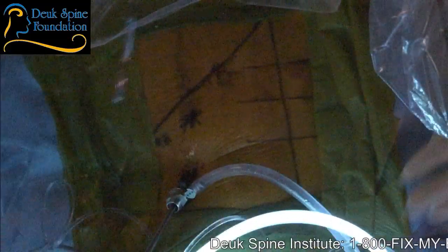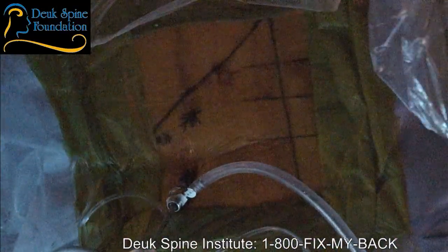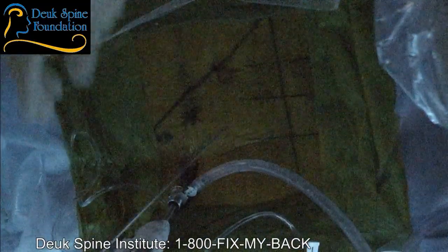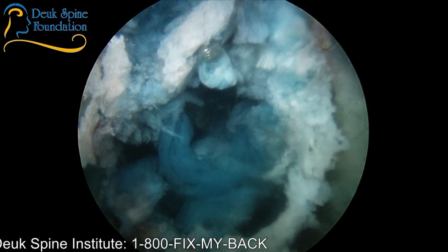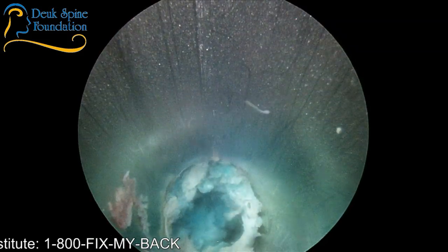Can you believe how far north I am? I could almost administer anesthesia from here. I'm so far north for L5S1. But there's the disc material, right? And so we're lucky we were able to get in here and get this done.